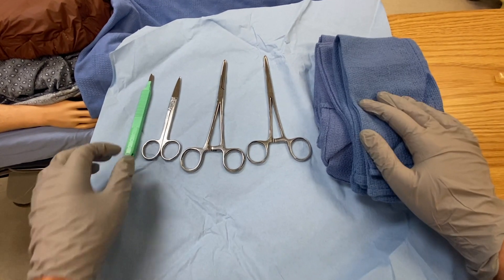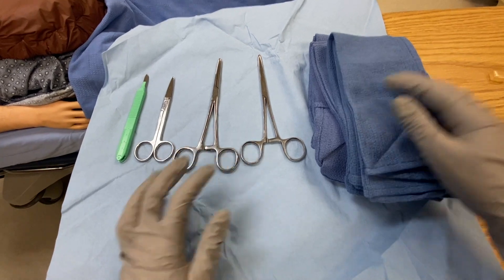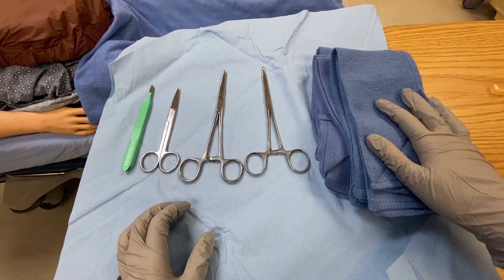So all you need for this procedure is a scalpel, a pair of scissors, two clamps, and a bunch of blue sterile towels.